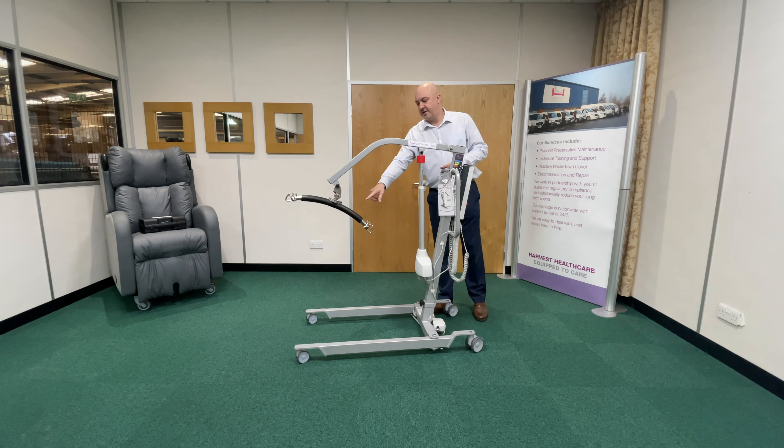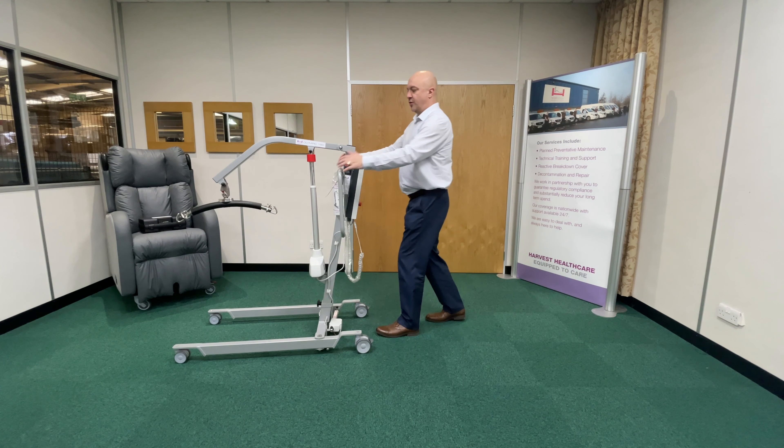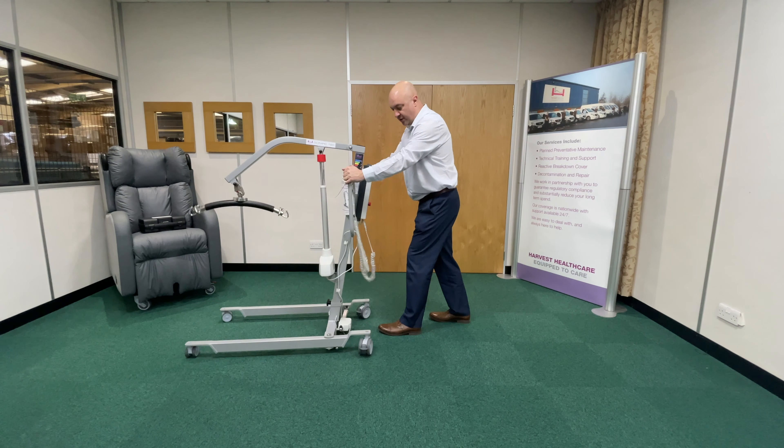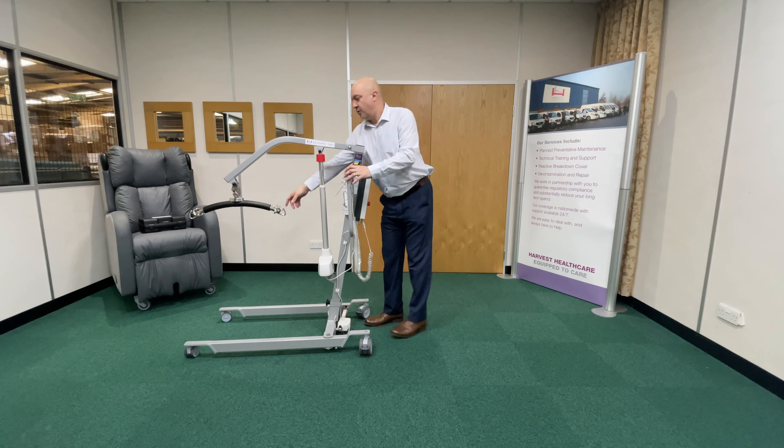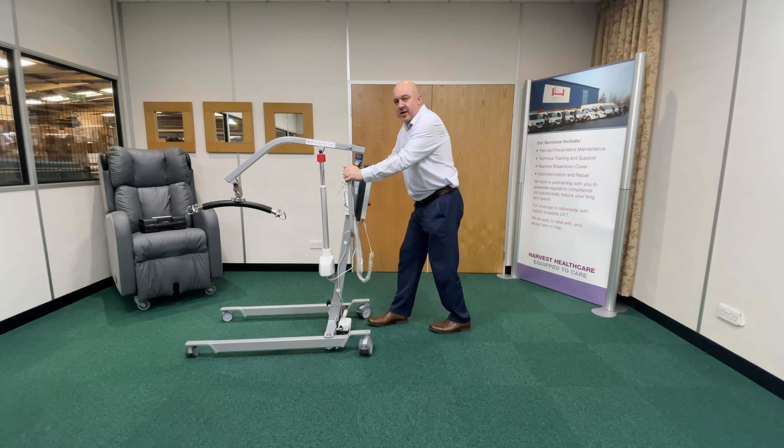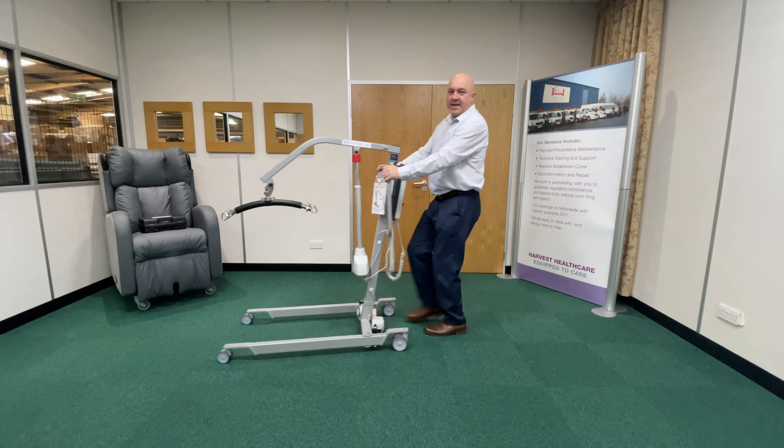You'll also notice that the carry bar is starting to swing as well. This is most prevalent when you're hoisting from a bed. So if I push the hoist under a bed and lift a heavy person, I've got to get that hoist to move backwards, and the casters will pause the hoist for a second when they spin into the carpet, causing swinging — and quite often you'll see carers doing this to get the hoist moving.